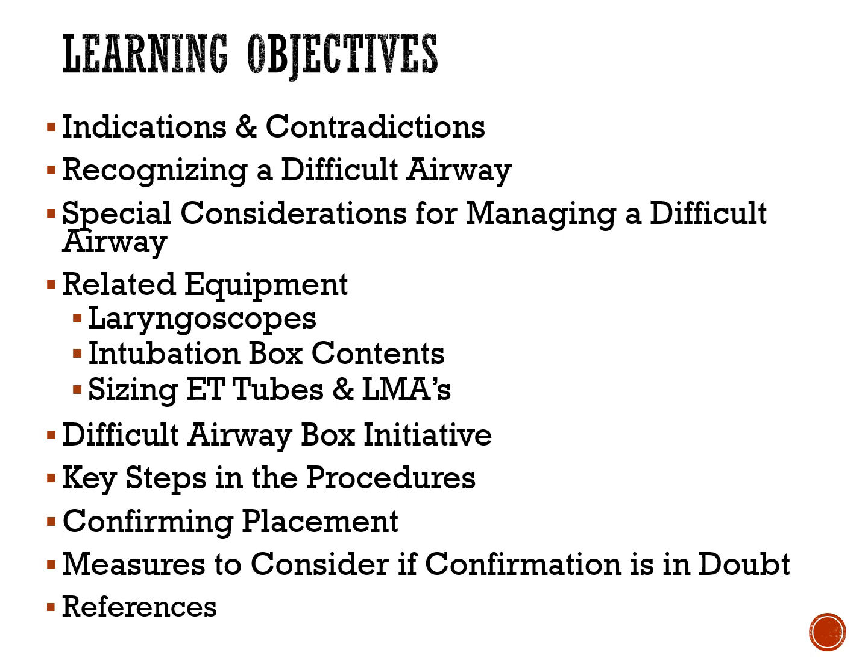We'll also be talking about the actual difficult airway box, if your facility actually has them. It is strongly recommended that institutions that do intubation have them strategically located throughout their facility. The funky thing about difficult airway is, again, in some cases, you don't know it's going to be difficult until you find out it is. So it's always a good idea to have the difficult airway box in close proximity, again, if your institution has such an initiative.